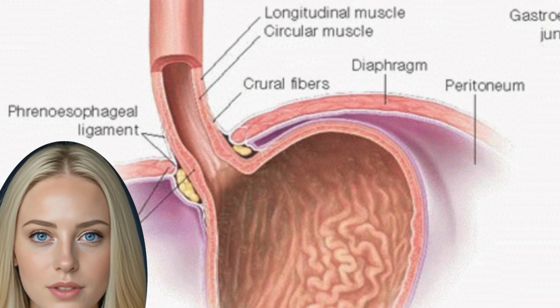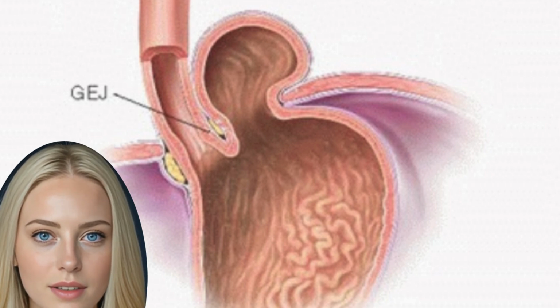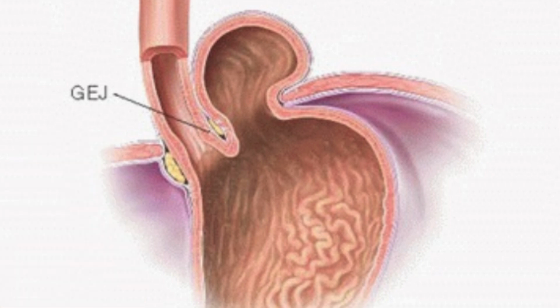Esophagram. The supine and upright plain film esophagram demonstrates static anatomy and can often locate the gastroesophageal junction, GEJ, in relation to the diaphragm, as well as deduce the presence of reflux on delayed films. Mucosal abnormalities can be seen with this modality as well.